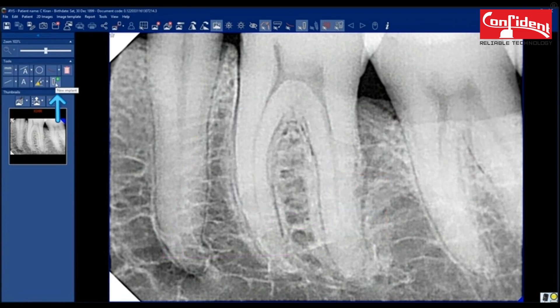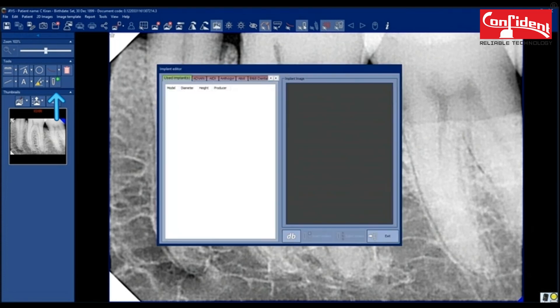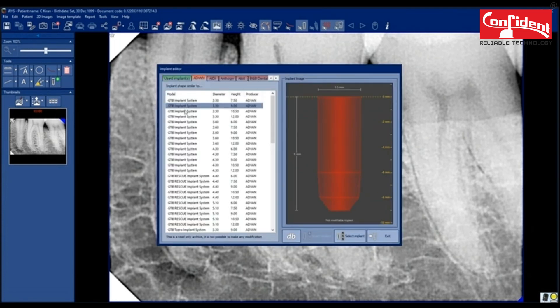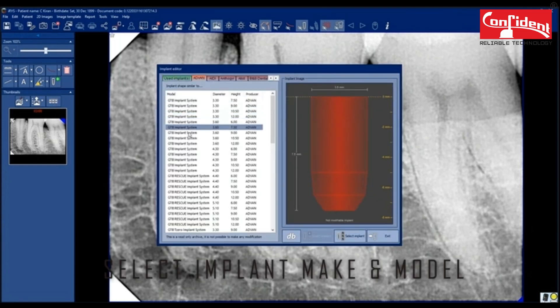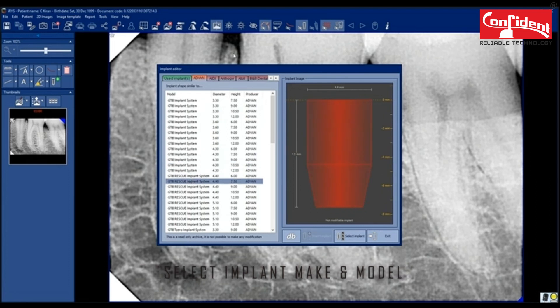When you click on implant tool, a pop-up window opens up. You can select the implant make and model from this list.